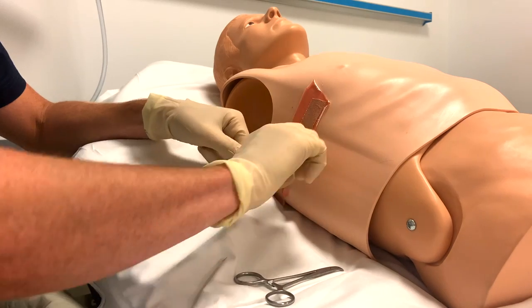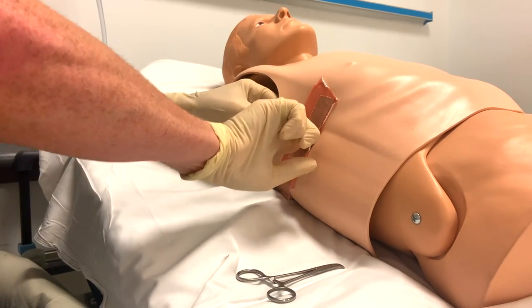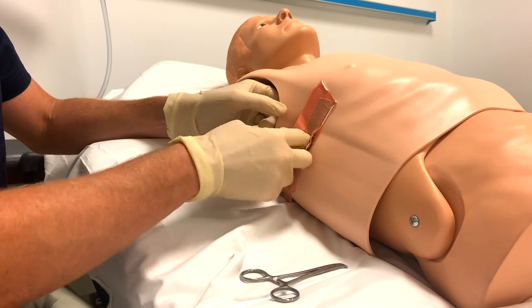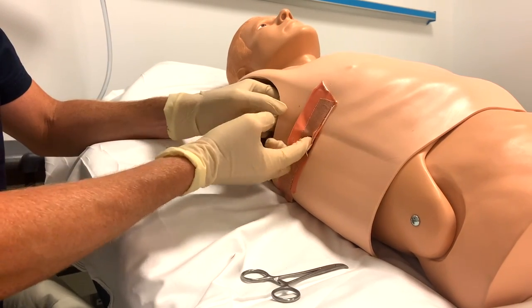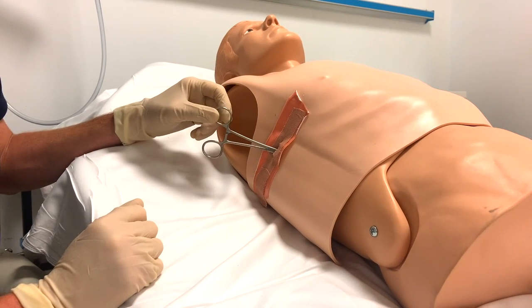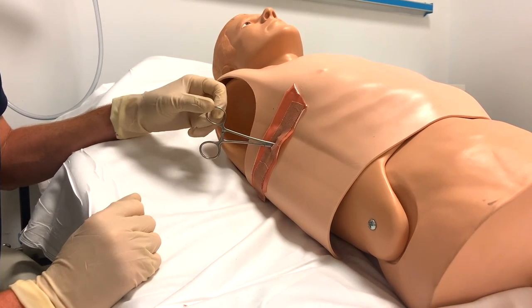Step three is sweep. Push a finger through and use it to sweep around to clear the path — that allows air or blood to come out and makes space for your chest drain to go in. Your last step of this part is keep: you need really good finger sweeping to help keep that hole open.